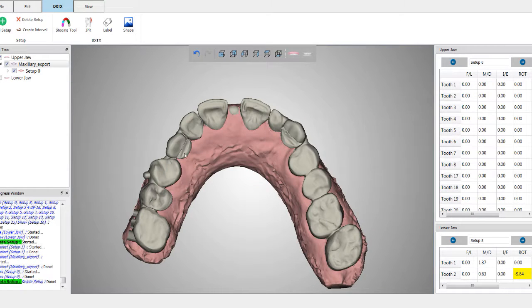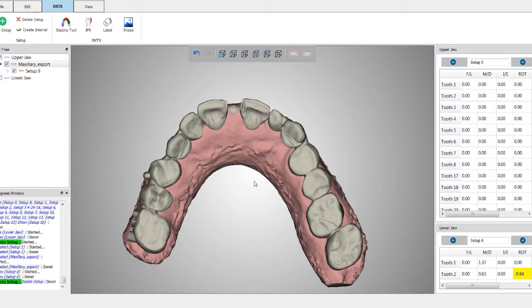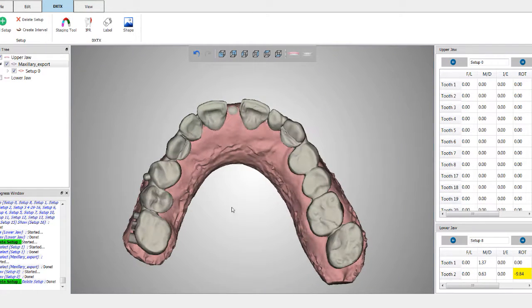Then we scan the patient with the Pontics in place, and then all the patient's going to do, as they're progressing through the aligners, is just pop these Pontics out and put them into the next aligner. And I found that to be the easiest and most aesthetic way of doing this, because the Pontics look very nice, and they just pop into the aligners very, very easily. So just a quick tip on something that I'm doing that has been working very, very well.